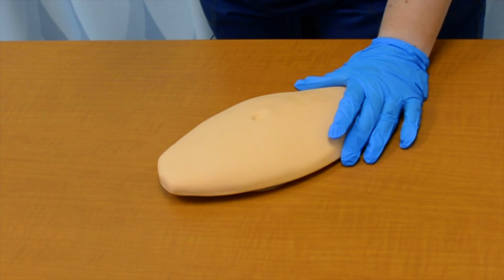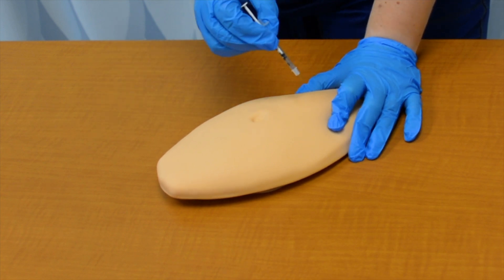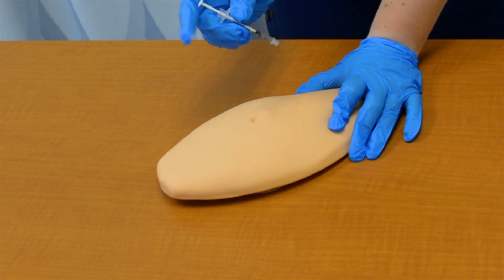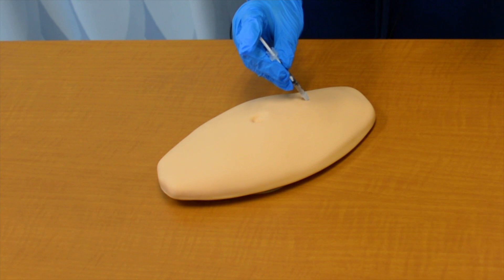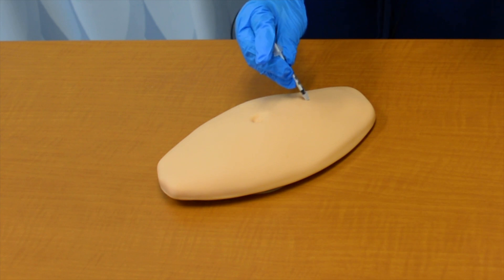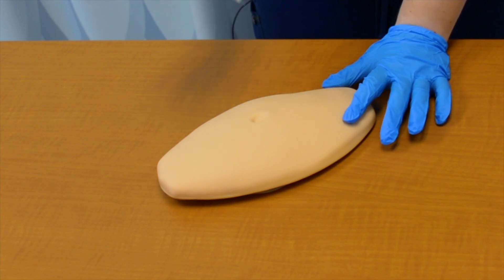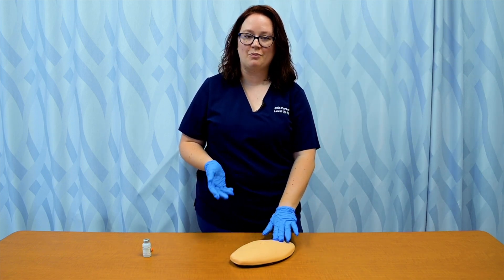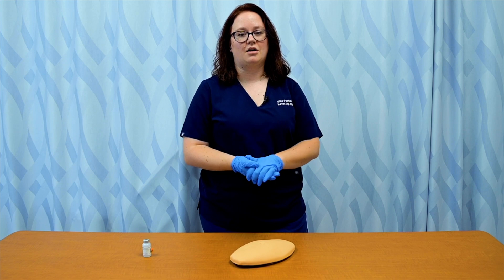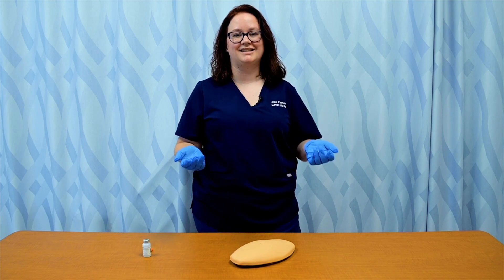I uncap my needle and pinch the subcutaneous tissue up — which is a little difficult on these mannequins. I'm going to do a 45 degree angle for this patient. I insert my needle, let go of the pinch, inject my medication, and then take the needle out at the same angle I inserted it. I then immediately waste the needle into my sharps box. I can apply a piece of gauze or a bandage if needed, but like all injectable medications, I do not massage the site. Just let it be — and he's gotten his insulin.